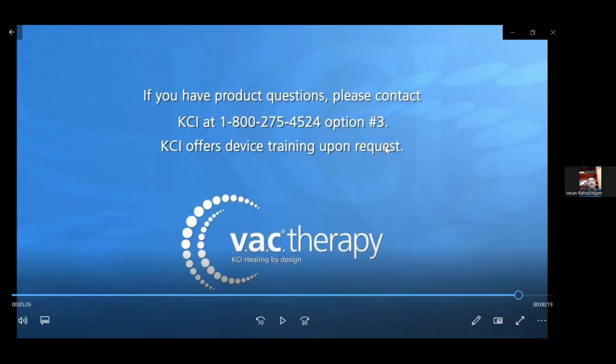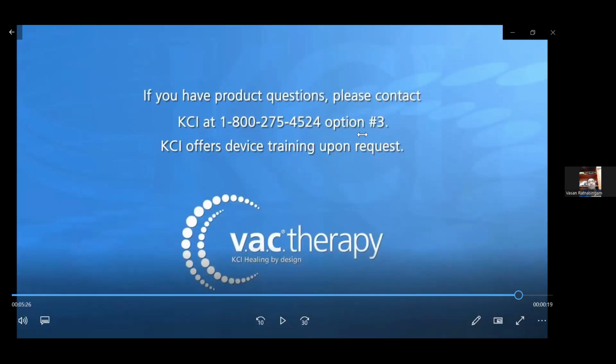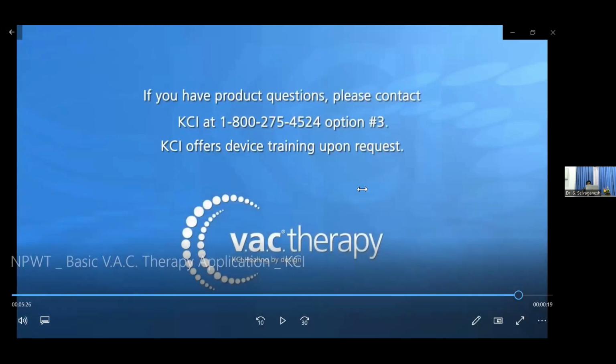What is the average cost of this therapy? The machine is provided by the companies. They rent it, and they charge only for the foam. The foam is available in three sizes: small, medium, and large. Before the economic crisis, the large foam was around 45,000, but now it has gone up to around 60,000. The smaller one is around 30,000, then 45,000, then 60,000.